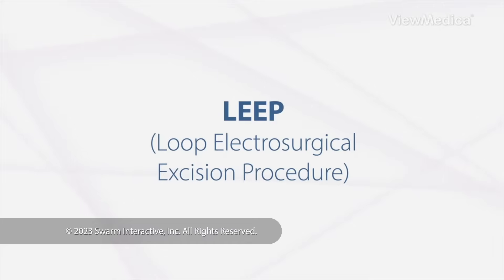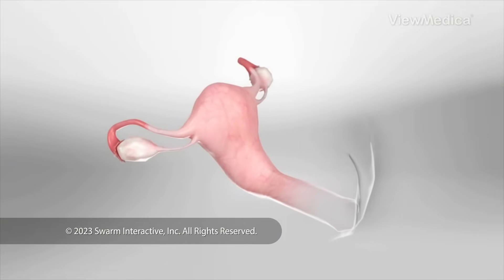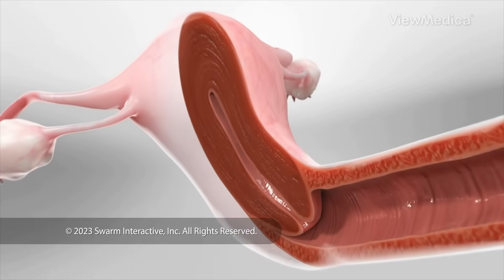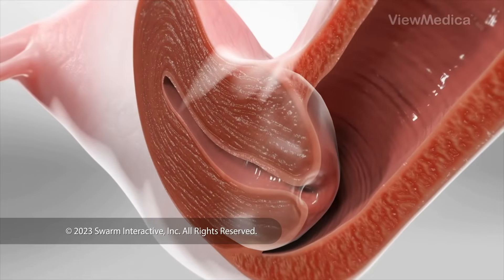LEEP — Loop Electrosurgical Excision Procedure. This procedure removes abnormal tissue from your cervix. Your cervix is the lower part of your womb. LEEP helps us diagnose and treat problems with the cervix.